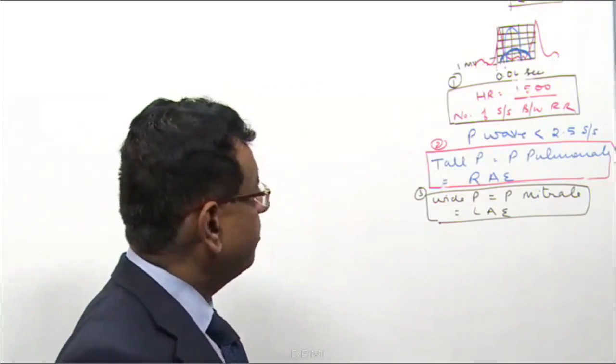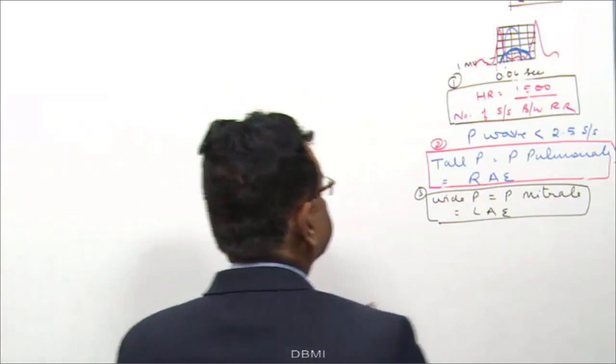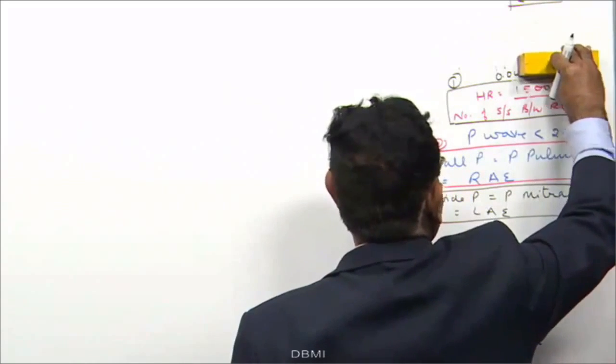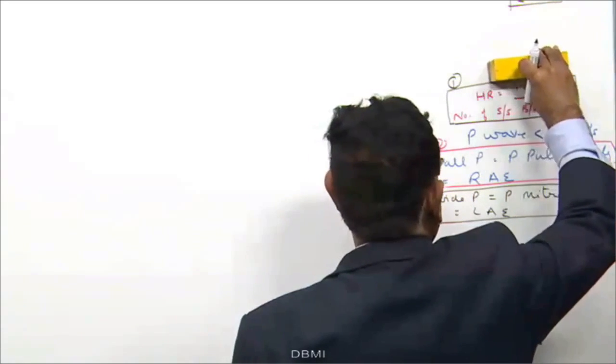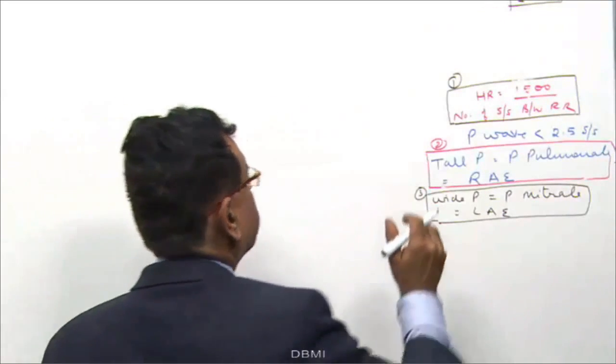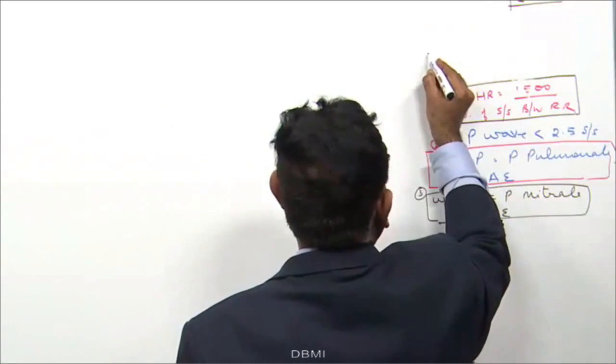Now we move on to PR interval. I think I can rub it out now. So now we talk about PR interval. This is the P wave.